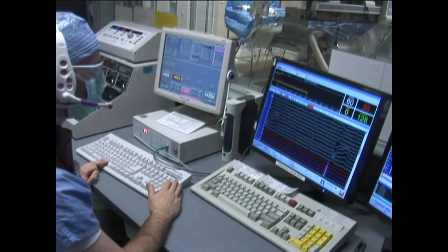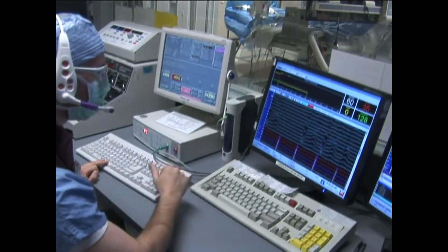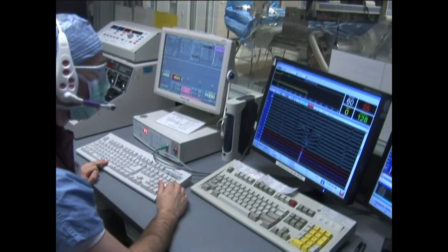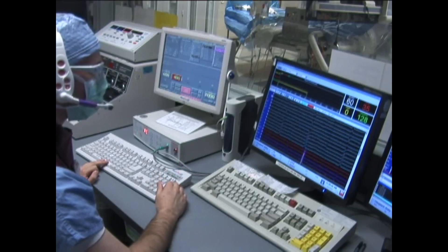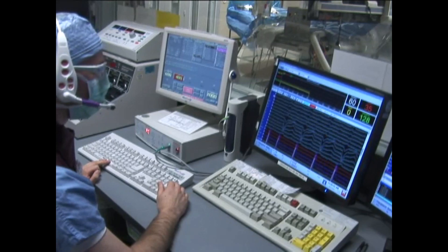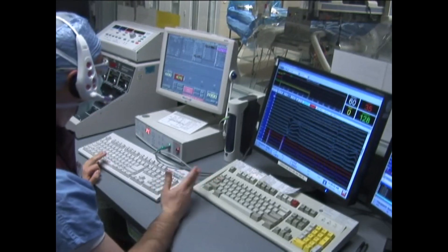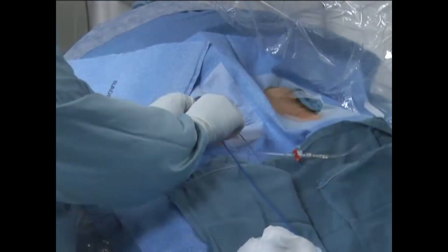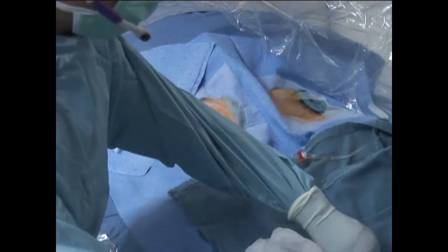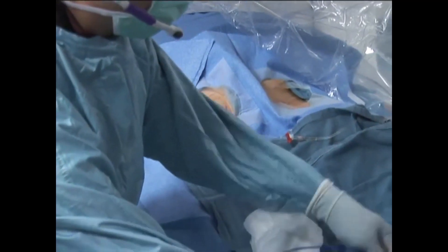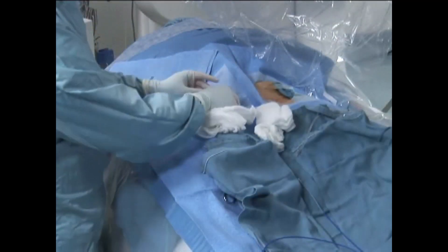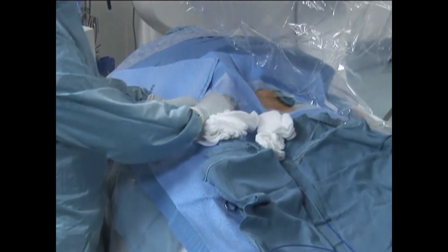If there are no spontaneous PVCs or ventricular tachycardia during the waiting period, attempts are then made to re-induce the arrhythmia using the methods that initially induced the tachycardia, often with the reintroduction of isoproterenol. Once the waiting period has been completed and the arrhythmia cannot be re-induced, the catheters can be removed from the body. The sheaths are then removed with manual hemostasis obtained.